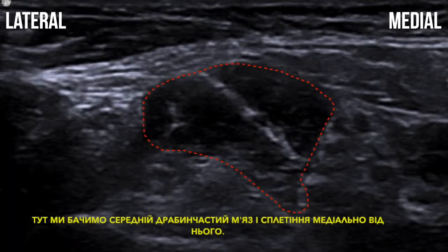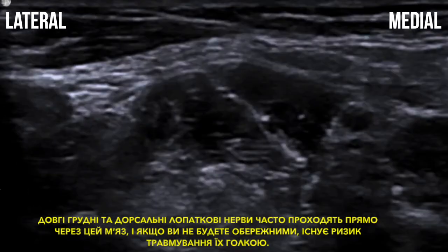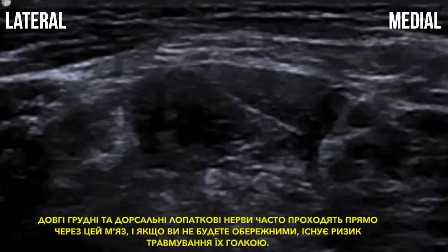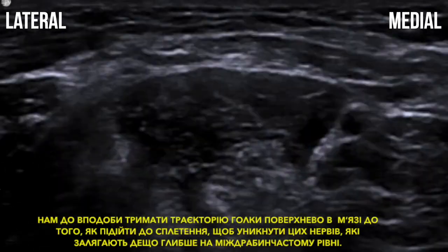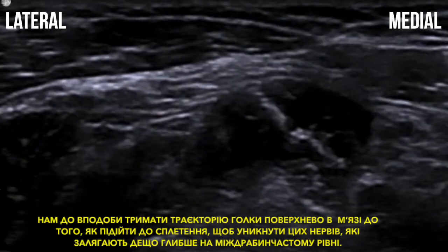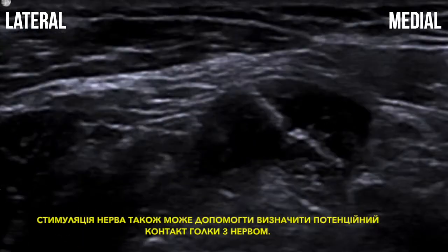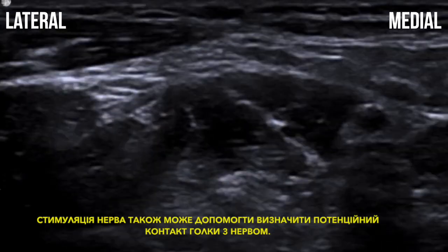Here we see the middle scalene muscle and the plexus medial to it. The long thoracic and dorsal scapular nerves often pass right through this muscle, and if you're not careful, they can be at risk for needle trauma. We like to keep our needle trajectory superficial in the muscle until reaching the plexus to avoid these nerves, which are usually somewhat deeper at the interscalene level. Nerve stimulation can also help identify potential needle-nerve contact.